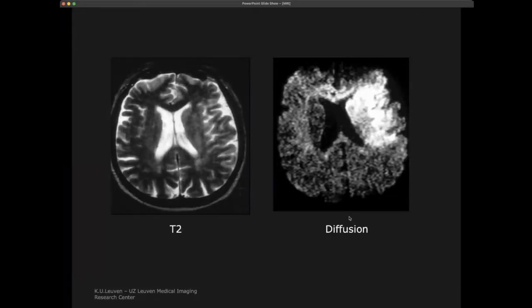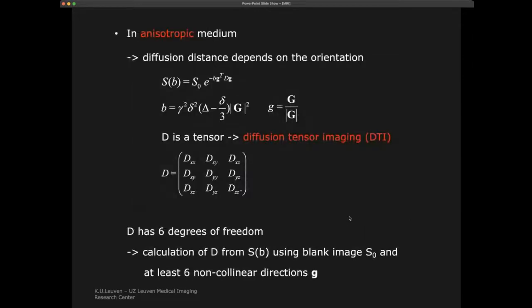You will always do T2 weighted, T1 weighted, potentially proton density weighted, and then on top of that you might do different images, like diffusion imaging, or when we look at fast velocities, flow or blood flow images in the larger vessels and things like that. So it's complementary.